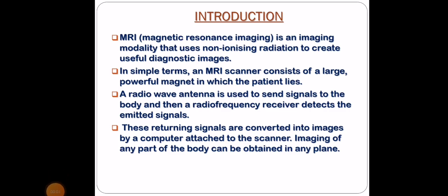Hello friends, today I will be discussing the basic principles of MRI. MRI stands for magnetic resonance imaging. What is magnetic resonance imaging? This is an imaging modality that uses non-ionizing radiation to create useful diagnostic images. X-ray uses ionizing radiation, but MRI doesn't use ionizing radiation.